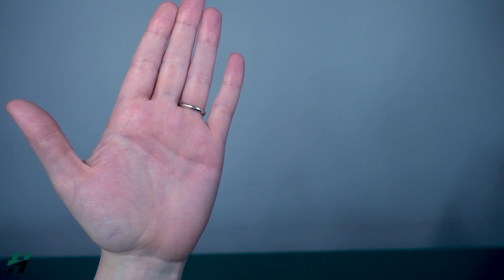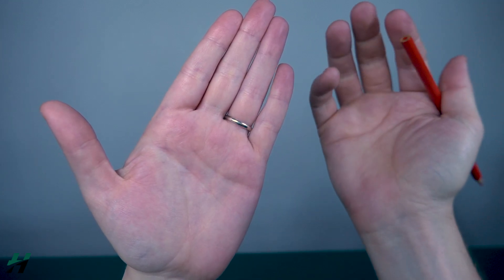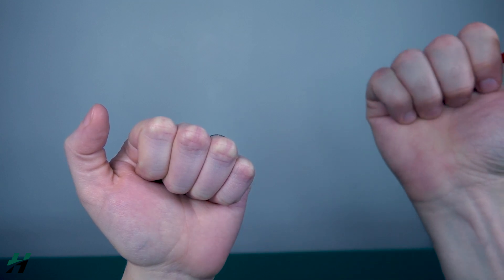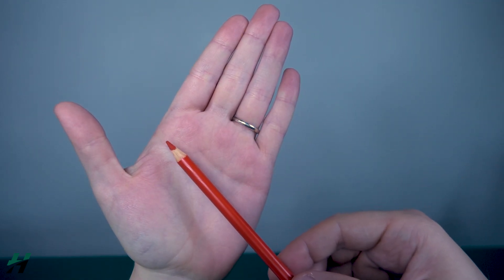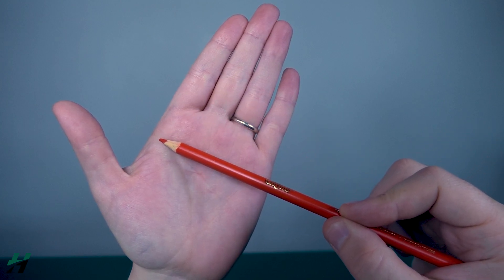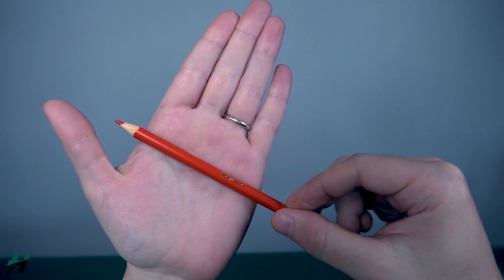Measuring digit composite flexion: the patient should be seated with their elbow on a table or solid surface and hand extended in the air. The goal is to find the distance between the tips of the fingers and the distal palmar crease. To locate the distal palmar crease, find the creases on either side of the palm and make an imaginary line connecting them — that line is the distal palmar crease.